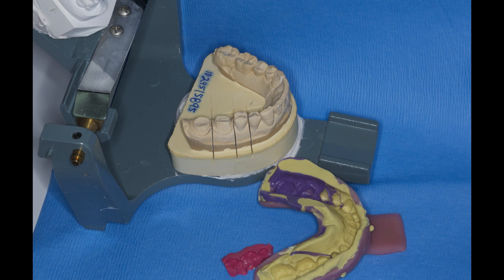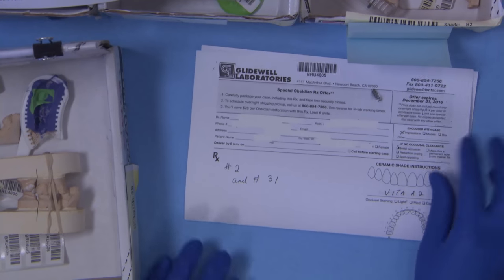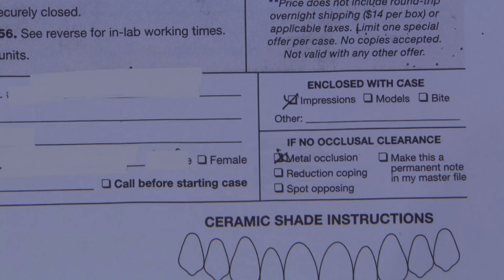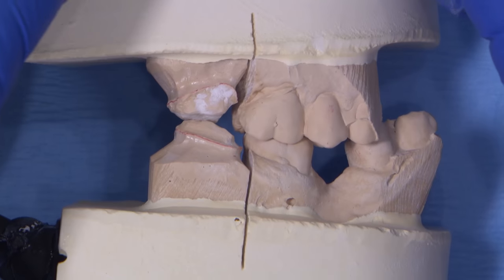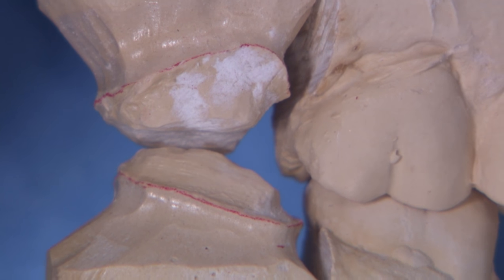On case number two, knowing there is limited occlusal room between the preps of number 2 and number 31, the doctor requested two metal occlusal crowns. However, when looking at the articulated models, the technician still thinks the room is tight.